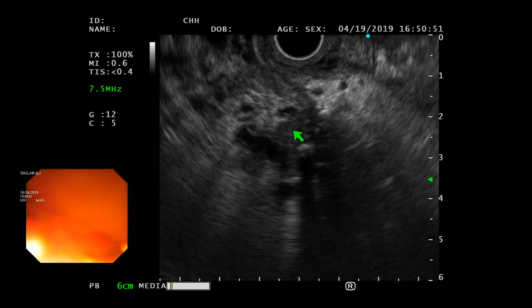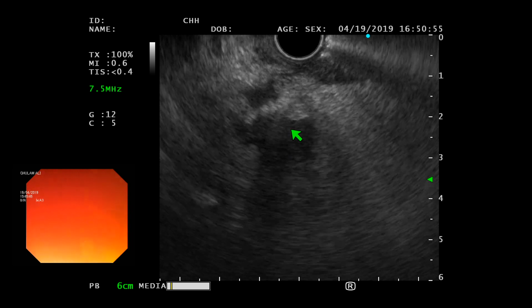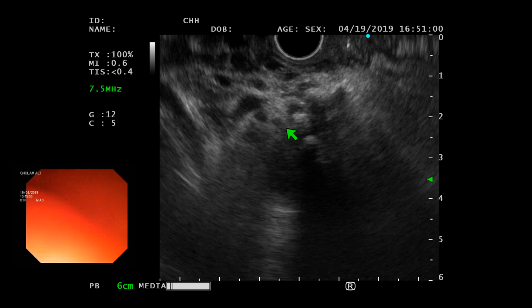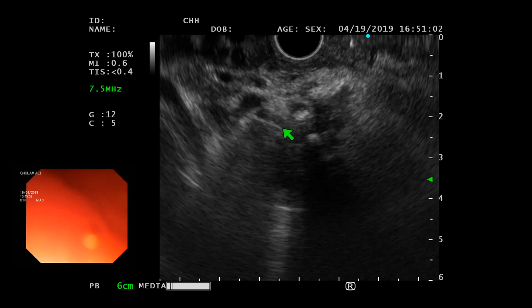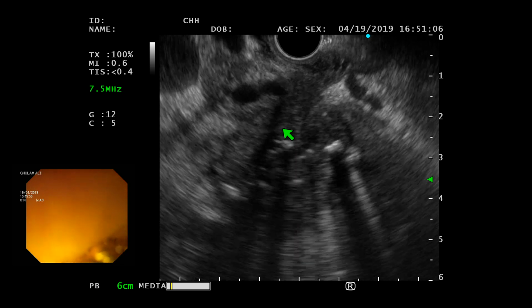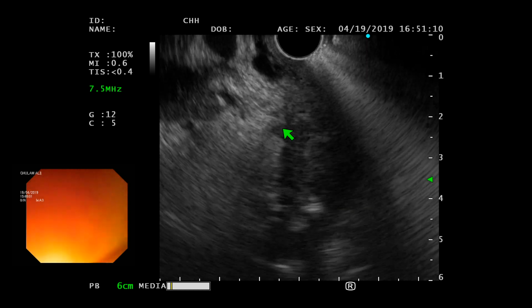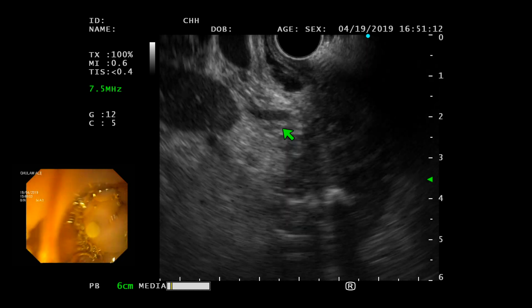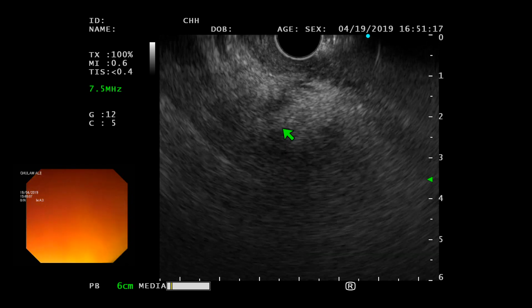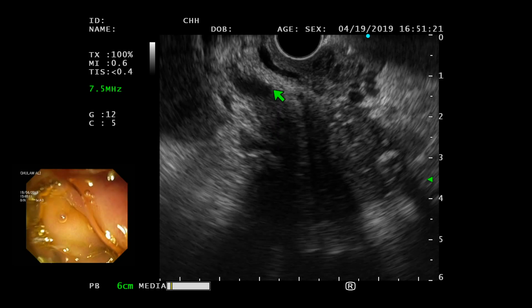And what I do is I try to start from here, so I have a lot of space for me to do the rotation. If you start from here, you have no space. वो फिर पीछे की तरफ देखना पड़ेगा. फिर इधर से शुरू करना. हाँ, ये देखें, this is the head area. So you see the calcification and all that necrosis there. So I can see that from the duodenal bulb, head area. If you are in the right place, it's very easy.